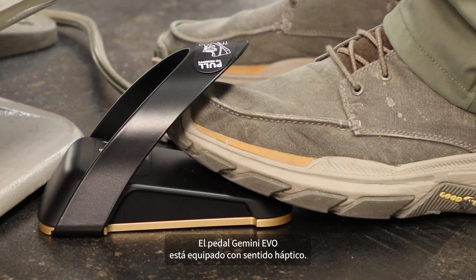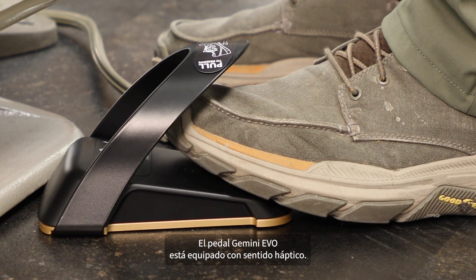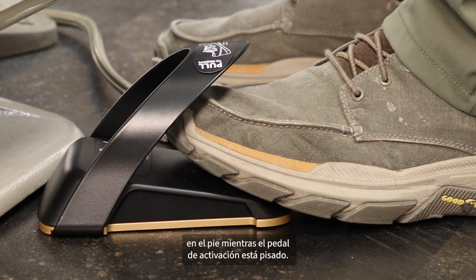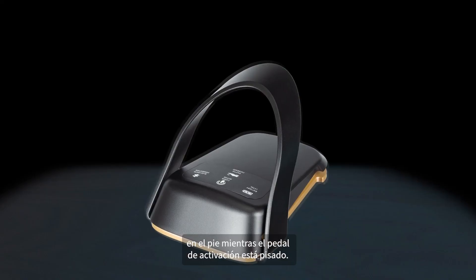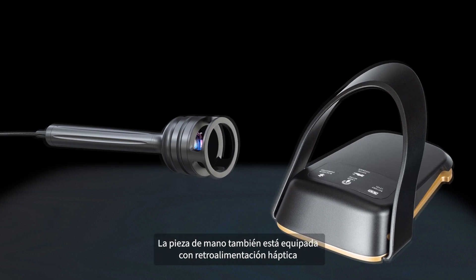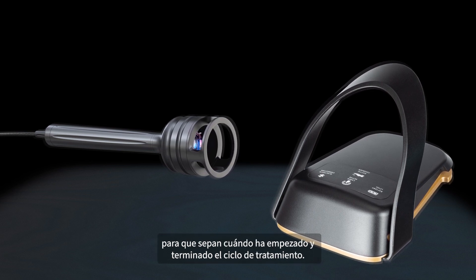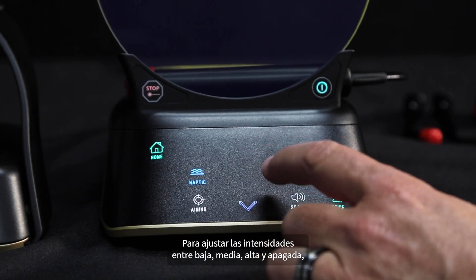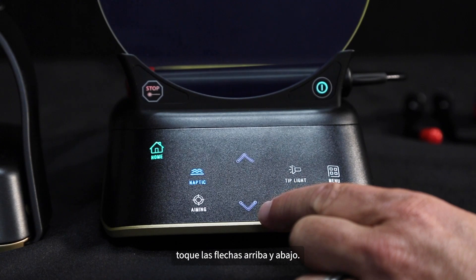The Gemini Evo foot pedal is equipped with haptic sense. As you press the pedal, you will feel a buzzing sensation to the foot while the activation pedal is depressed. The handpiece is also equipped with haptic feedback in PBM mode to provide the patient with the same sensation to let them know when the treatment cycle has started and ended. To adjust intensities between low, medium, high, and off, touch the arrows up and down.